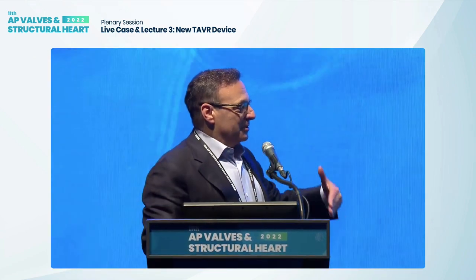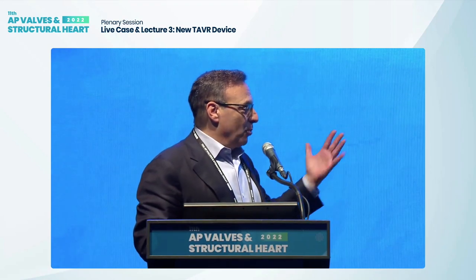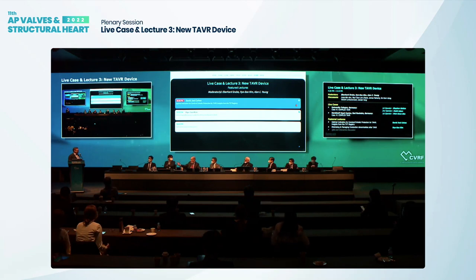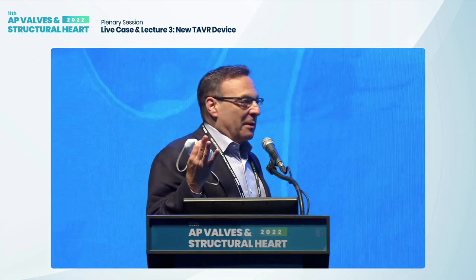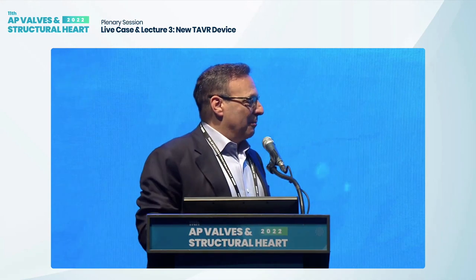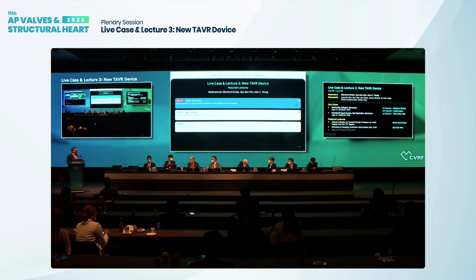Show of hands down the panel here: who uses embolic protection in more than 50% of your TAVR procedures? I struggled with deciding who. I had two major strokes in the last 5 years and I didn't use it, and I thought I was making the right decision. And I realized I don't know. I think the major ones, and again this is pure speculation, because you catch a big chunk, that's probably a major stroke that you prevent. And as an operator, those are devastating to you and to the patient. They are.